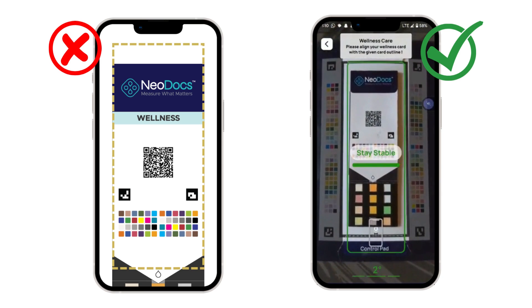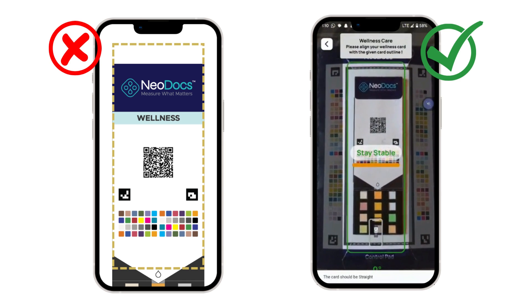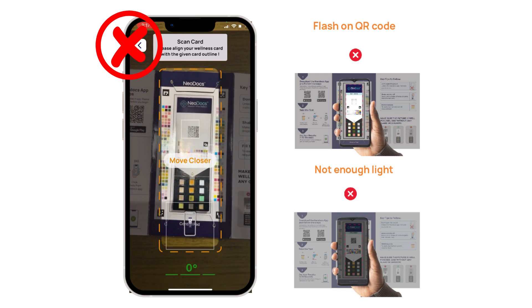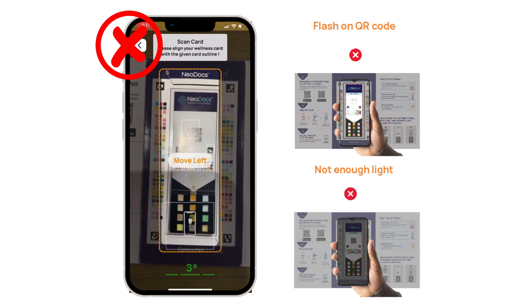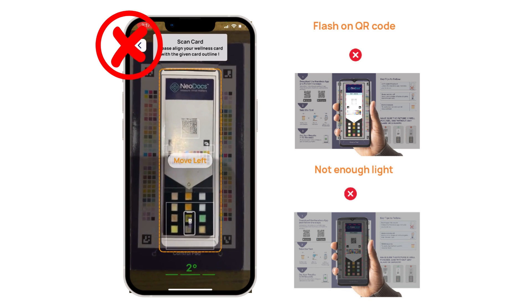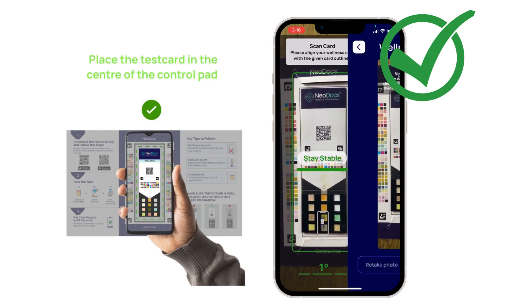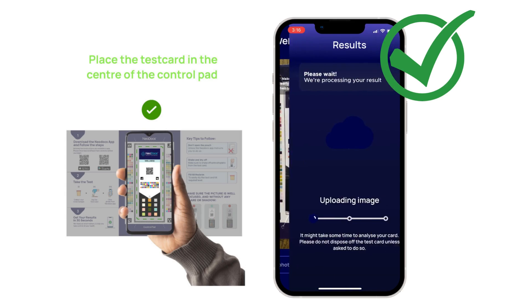It is important to click a photo of the full test card and not just the QR code. Key points to note: the phone won't be able to capture the test card if there is a glare or shadow on it. So please make sure you place the test card under good lighting and avoid any glare or shadow. You have to click the picture immediately within 20 to 30 seconds of closing the timer.